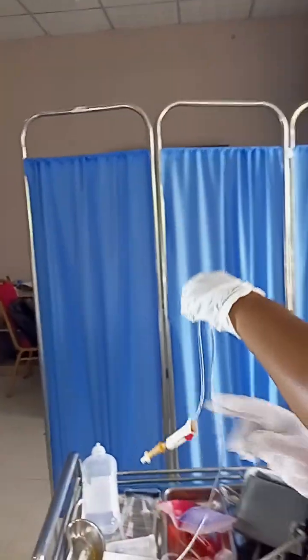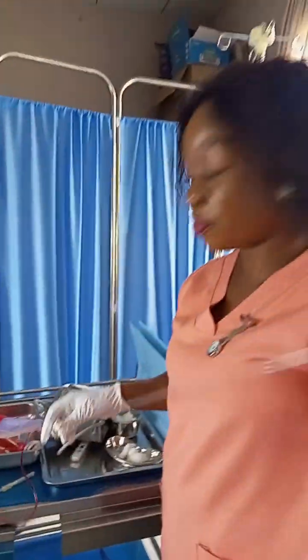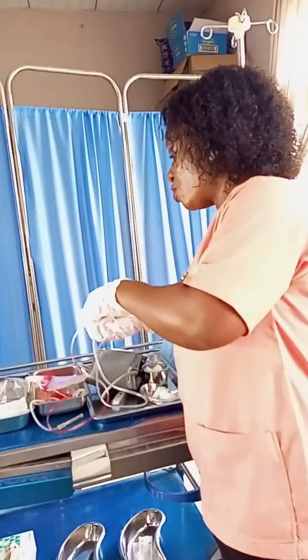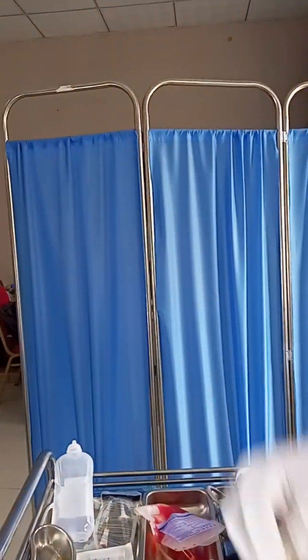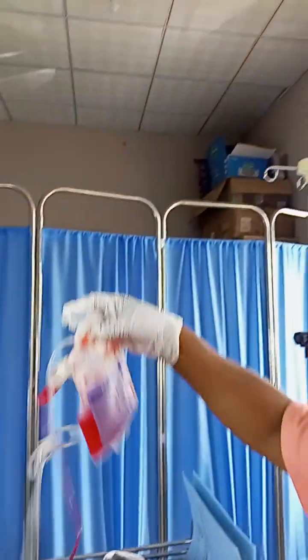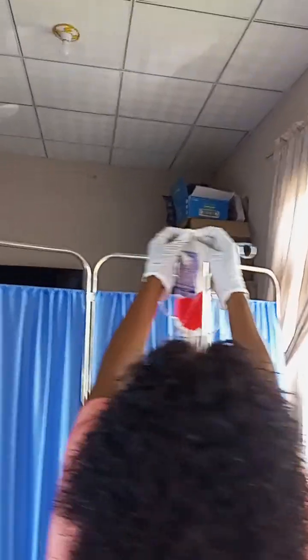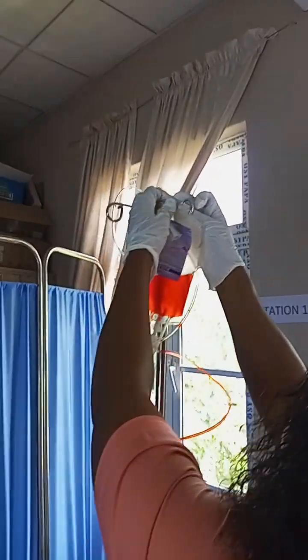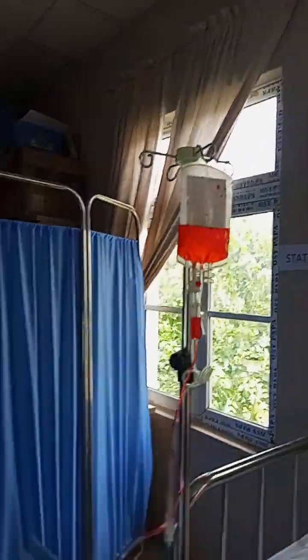Do not forget, when you want to fix it, you have to close the control, close it, and then hang it, so that the blood will not spill on your uniform or on the patient. Don't mind my height.